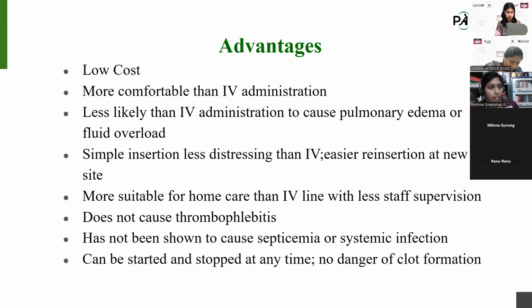If the caregiver is trained in subcutaneous site insertion, it is very easy to take care of at home also. And it needs less supervision, because only trained persons do intravenous infusions and cannula insertion and all. But if the caregiver is trained in this, less supervision is needed for subcutaneous insertion in home care settings.